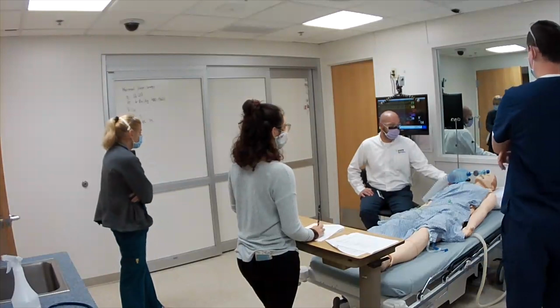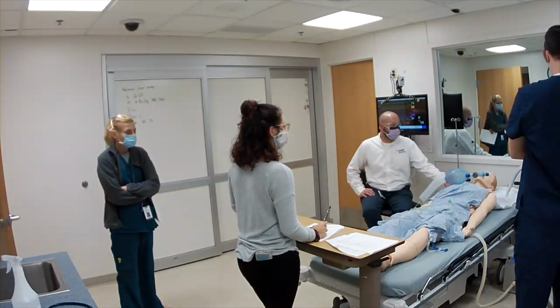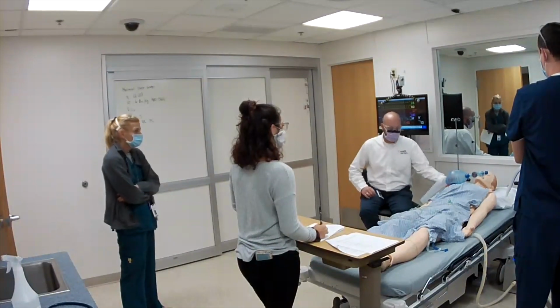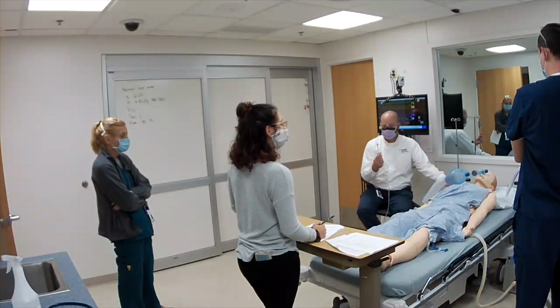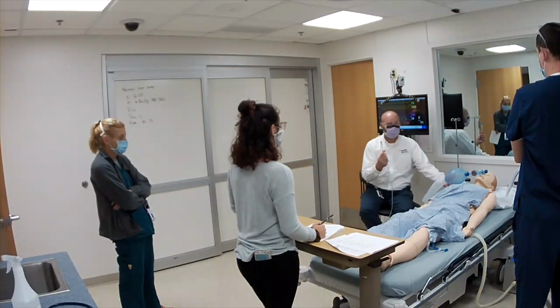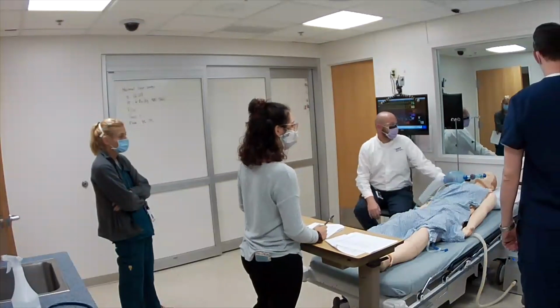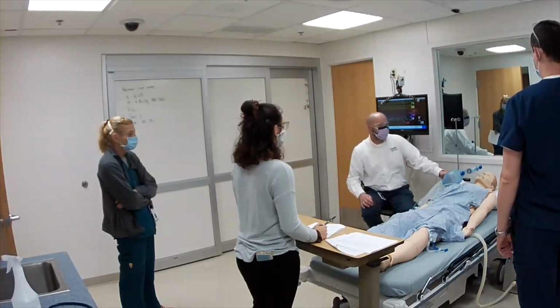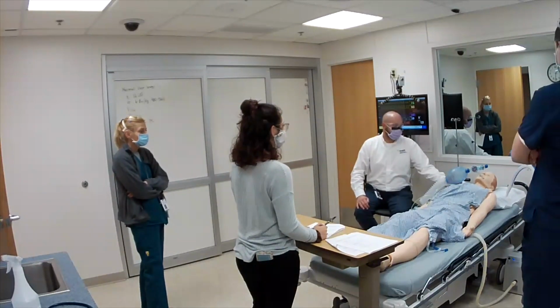I was going to say in peds we have more on room air. Adults, it's almost always 25 or 30. It seems like we do a lot more at that 25 or 30, which I don't really understand, because if you're ventilating on room air, I don't see why we need to do anything. But we tend to give them at least a little bit. Of course, when in doubt, we just turn up the FiO2 and we can always titrate it down. Better to overshoot it than undershoot it in the short term, right?